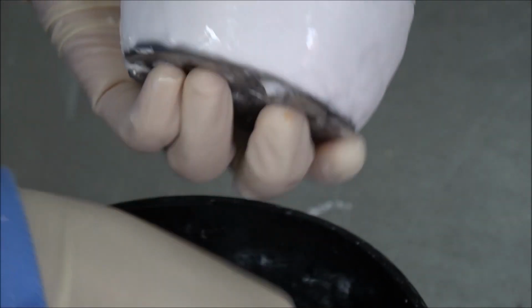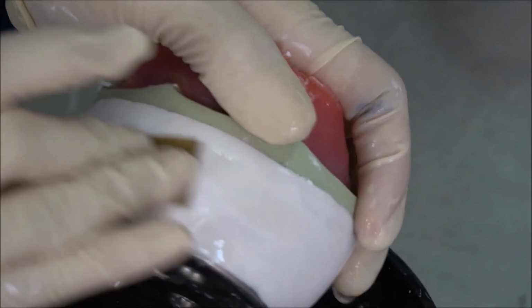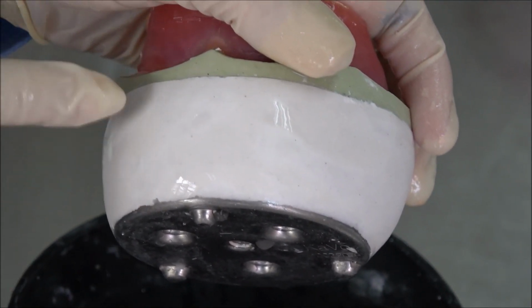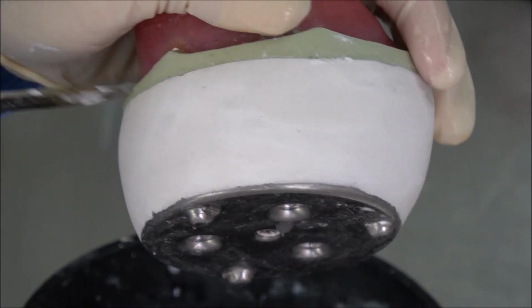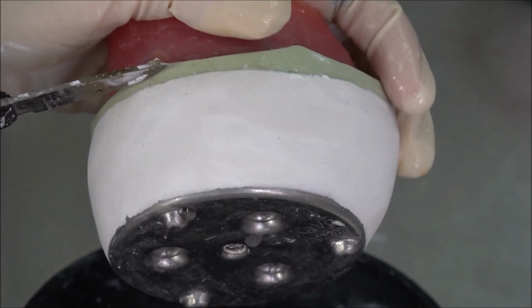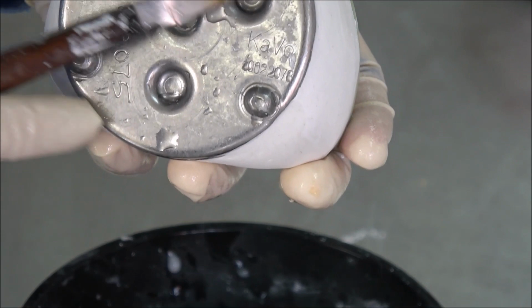To make sure it's smooth. All around, make sure it's smooth. Okay. Make sure you sand until smooth. If you can make it shining like this, better. Okay. All around, and then make sure, can you see the line covers half of the model, at least half of the model. If you cover a little bit extra, it should be okay, but at least half of the model. And then make sure here there is nothing.